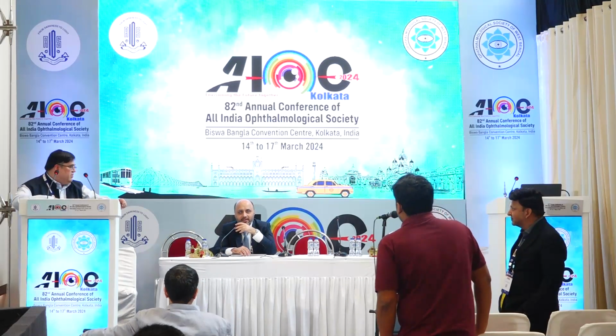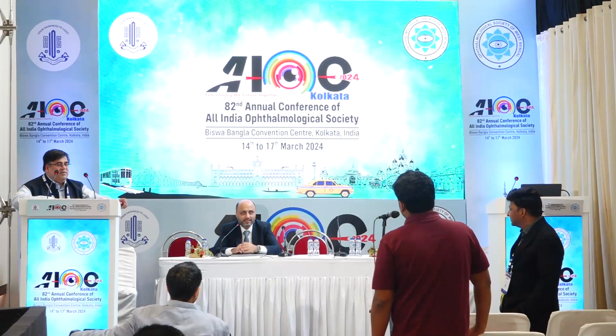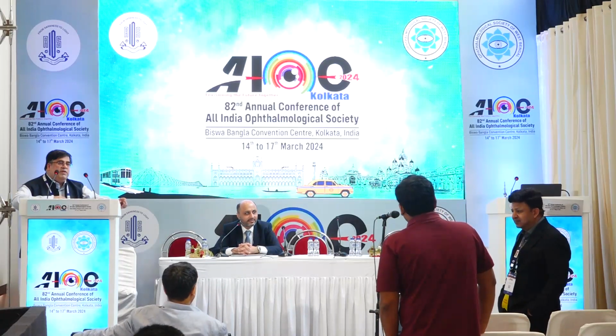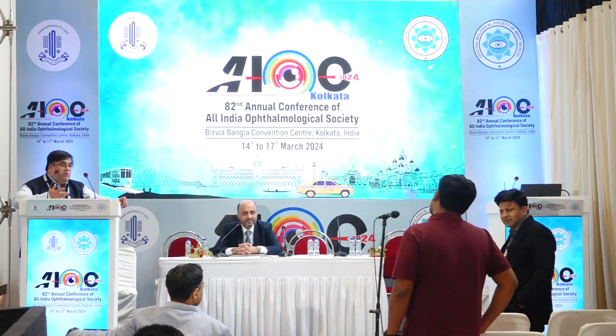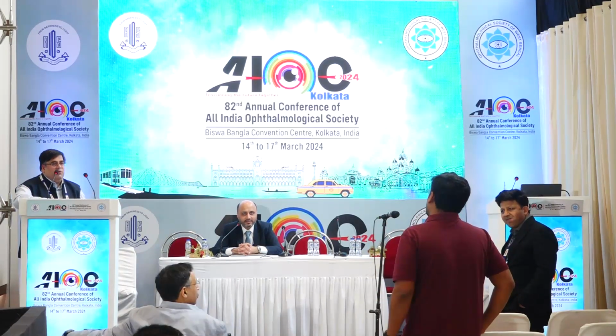Very large, thick bleeds, you will know that this is not going to go. In those, it's best to go in within 2 weeks. 2 weeks is also done so that at least the bleeders which have caused this bleed have in the meantime shrunk and coagulated, so that when you go in again, you don't encounter the same.